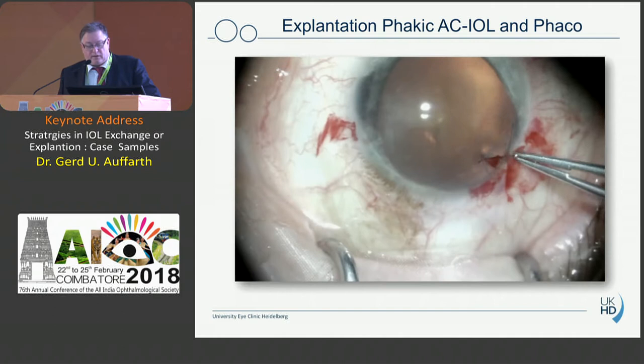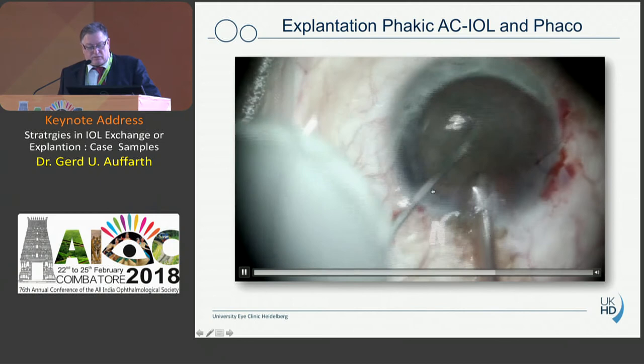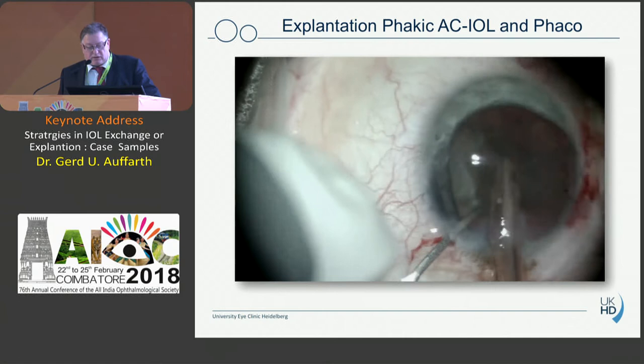This lens is an anterior chamber phakic IOL, 6 mm with a 5.5 mm optic. We do an incision after putting in the viscoelastic in order to get the lens out of the anterior chamber. I use a 2.5 mm knife and extend this in a frown incision in the limbal area to have about a 6 mm incision. Then we mobilize the lens and get it out — sometimes it is adhered to the trabecular meshwork or to the iris — then take it with forceps and dial the whole lens out.